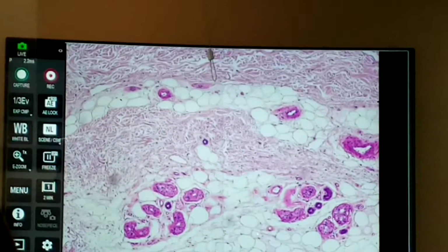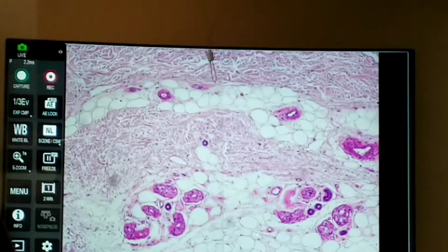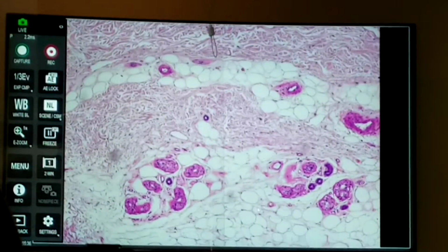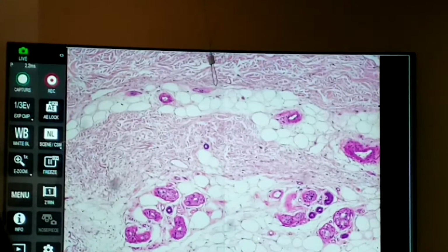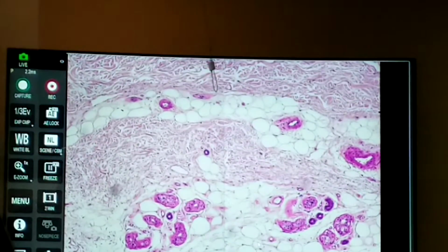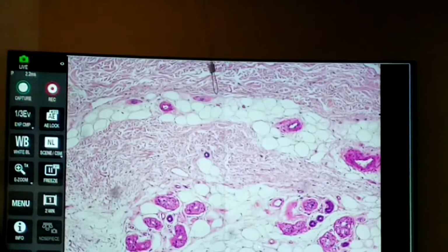When you cut through it, right into the slide, you get 1, 2, 3, 4, maybe 5 different cross sections. And so those 5 different cross sections kind of look like this, perhaps. Like 4 or 5 different structures, but they're all part of the same secretory unit.